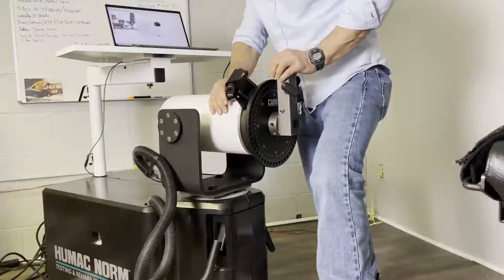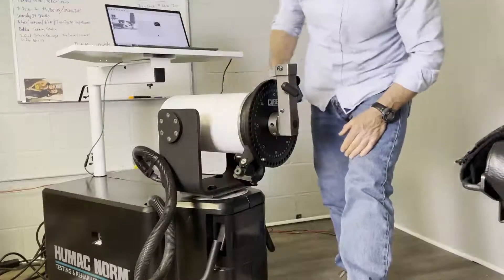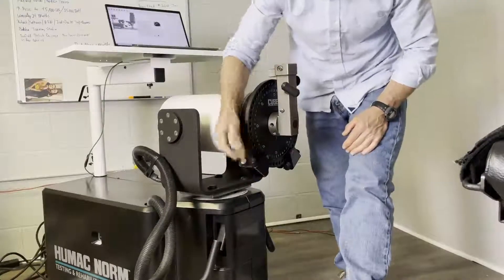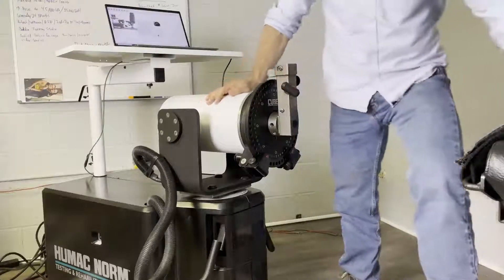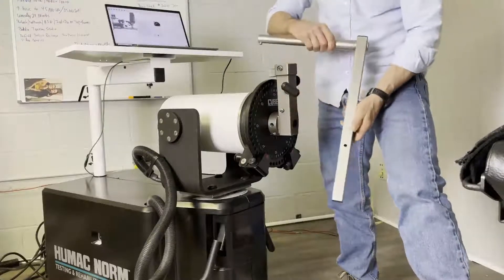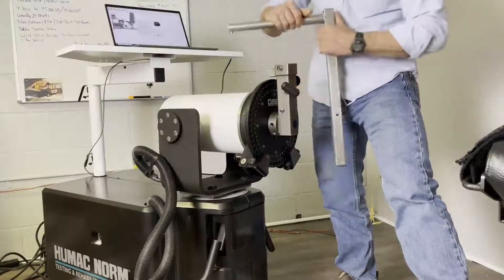Then it says set the ROM stops at teal U and teal gray. Close your ROM stops. Then set the knee hip adapter at 45. The knee hip adapter is this piece — there's only one hole in it, and when that hole is lined up with the pull pin, that's 45.